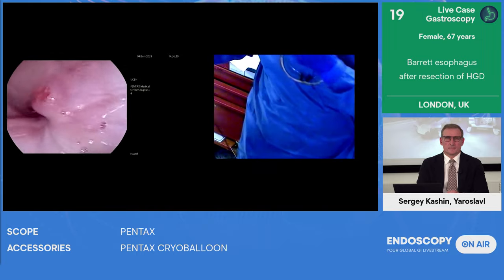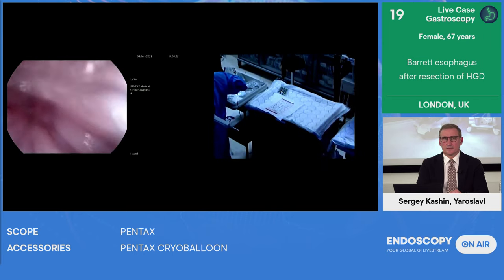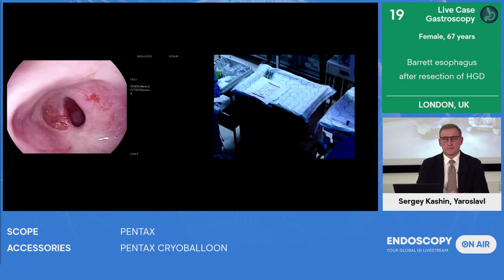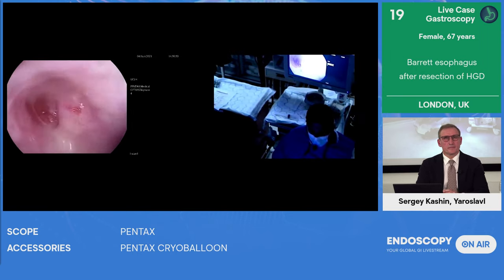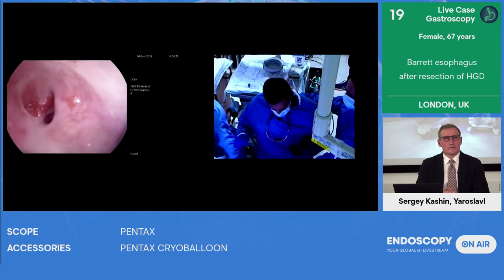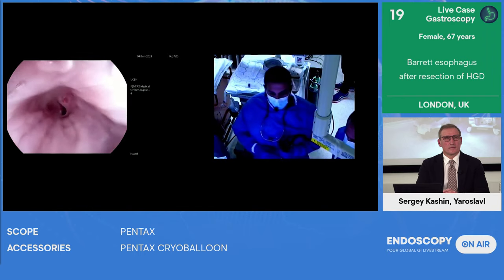I'll give this to you guys. The benefit of the pear balloon is that it's ideal for scarred segments of esophageal neoplasia, because as you can see in this patient here, I've got an endoscope down. This is a Pentax EG34-i10 scope. And the benefit of this scope is we don't compromise on the optics of the wonderful i-Scan imaging. It's got a 3.8 working channel, which means that I can get, can you just push the controller to my foot? You can get the cryo balloon down.